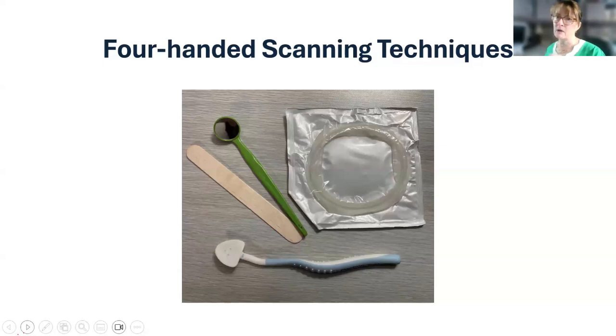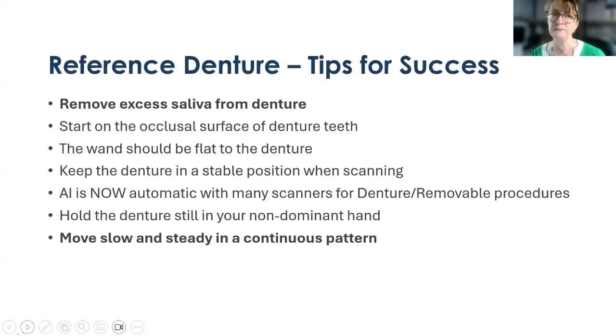And then the Optrogate, I have the backside of it here, but I don't know if anybody has used the Optrogates before. Sometimes it depends on the patient. Sometimes they're really helpful in retracting the lips and cheeks until you get to the buccal vestibules, and then it can get a little cumbersome. And that, again, is where bringing another person or employing four-handed dentistry can be helpful. And I'm always excited to learn about other techniques that people have success with. So if you're sitting there thinking, oh, well, I like this better, pop it into the chat so we can all learn together. That would be great.